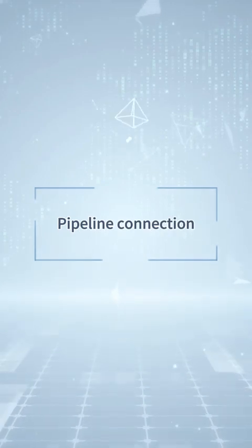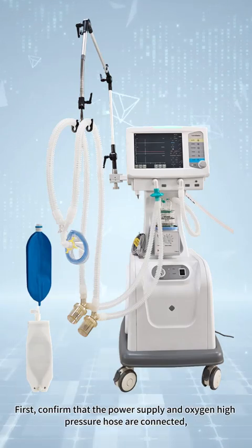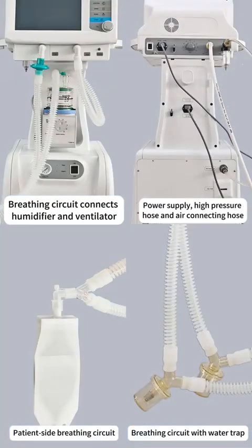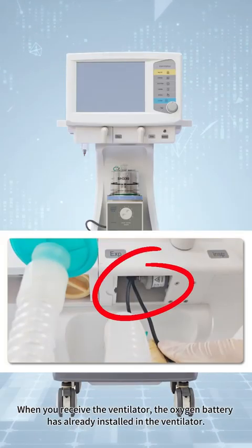Pipeline connection. First, confirm that the power supply and oxygen high pressure hose are connected, and the breathing circuit and other connections are correct. When you receive the ventilator, the oxygen battery has already been installed in the ventilator.